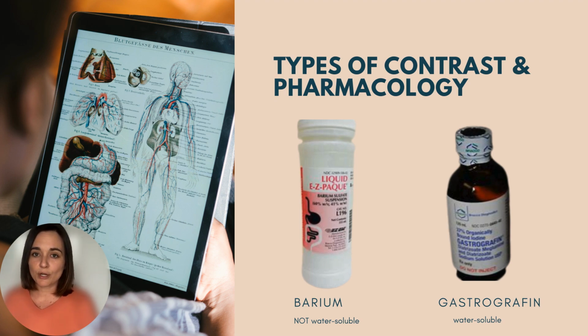It's hyperosmolar, which can lead to diarrhea or dehydration if used in large quantities, especially in kids, frail adults, or elderly patients with limited fluid reserves. It doesn't coat the mucosa as well, so sometimes it's followed by barium later for better detail.